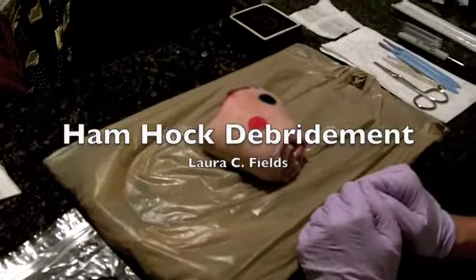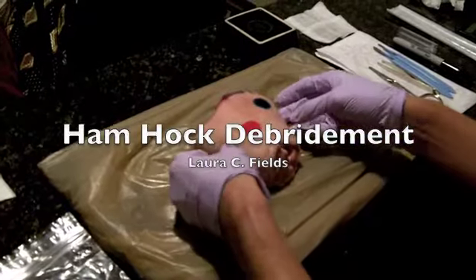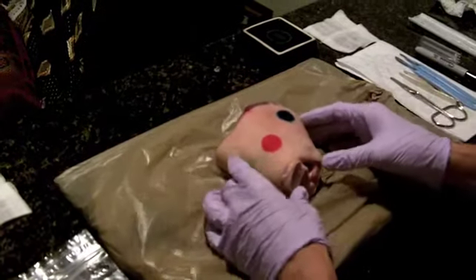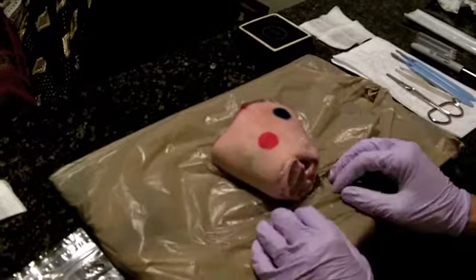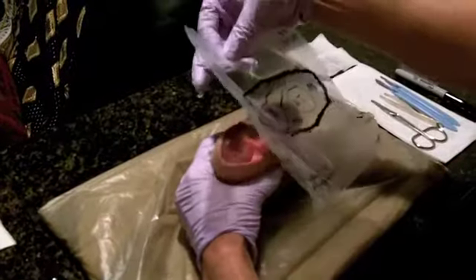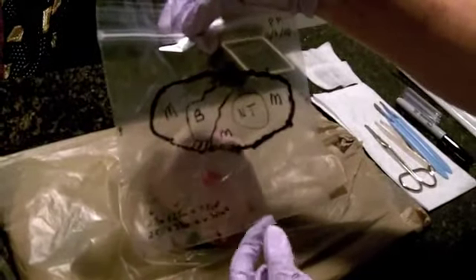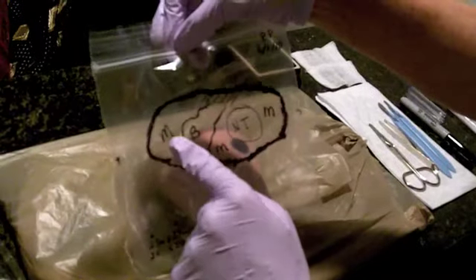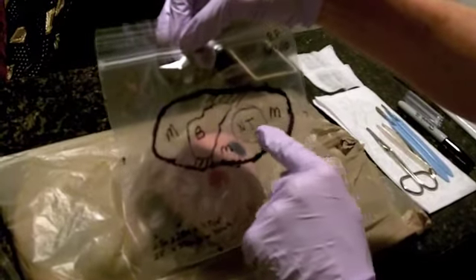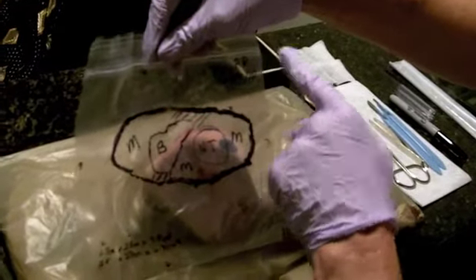My name is Laura Fields. This is the debridement video. This is my patient we'll be working on. I did the tracing, rolled up the ham hock and then just pressed it over it and made the tracing with the different delineation at the 12 and 6 o'clock orientation. So my muscle is there, the bone is there, the necrotic tissue is labeled there. I have up in the corner the patient's initials and the date.